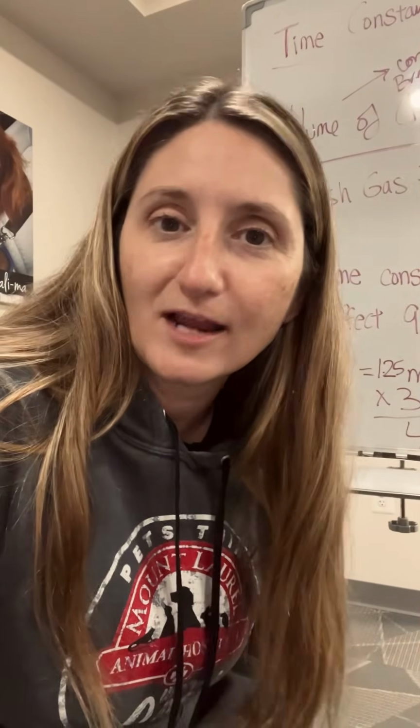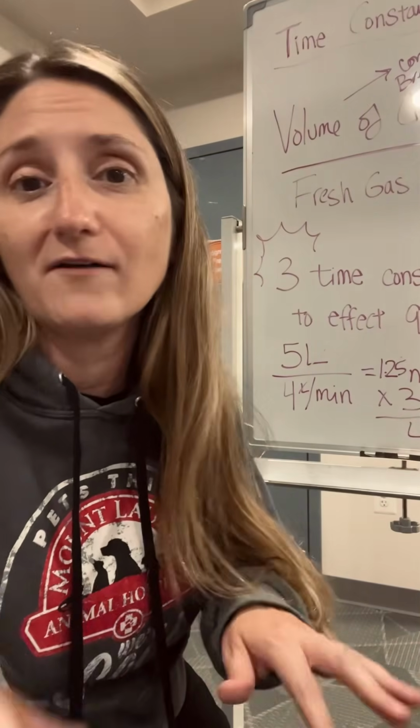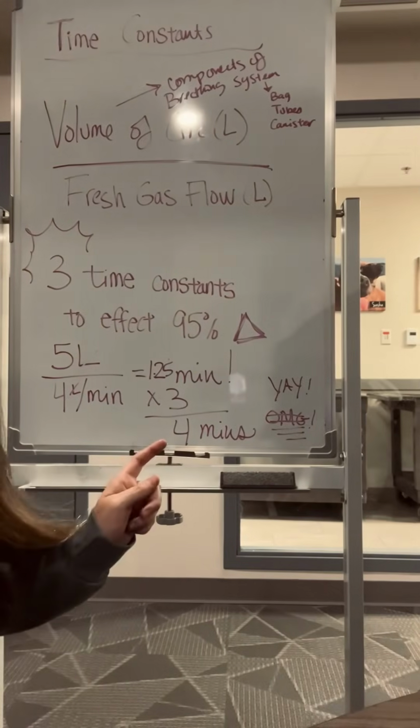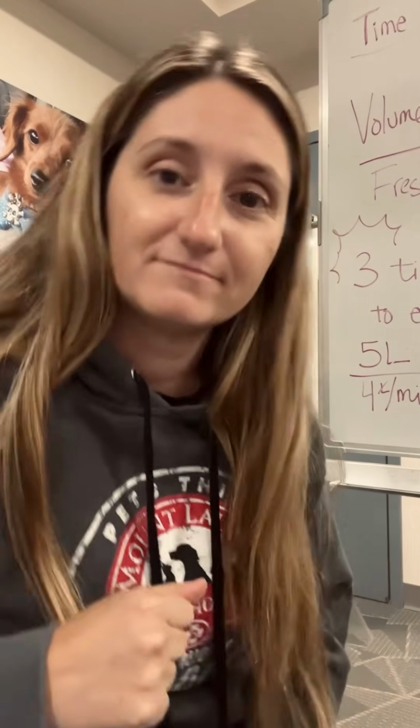Awesome. So remember, if the patient's moving under anesthesia, if you have a little extra propofol, alfaxalone, etc., just go with that. If not, remember, you gotta change your oxygen flow rate if you wanna make a change in your percentage quickly. Okay, bye.